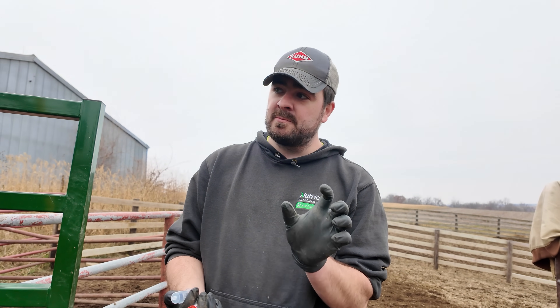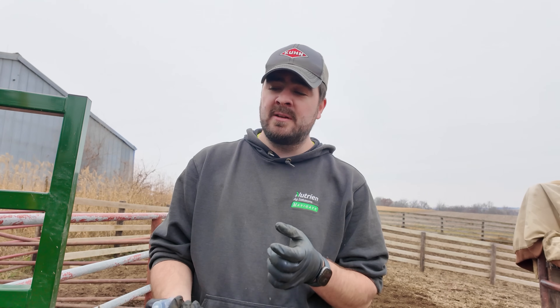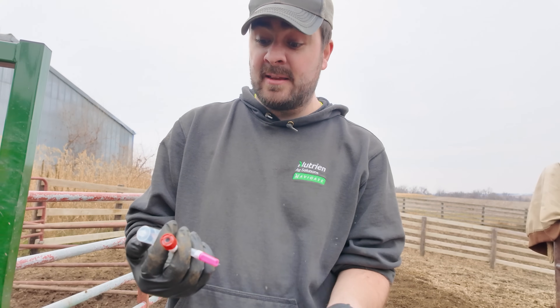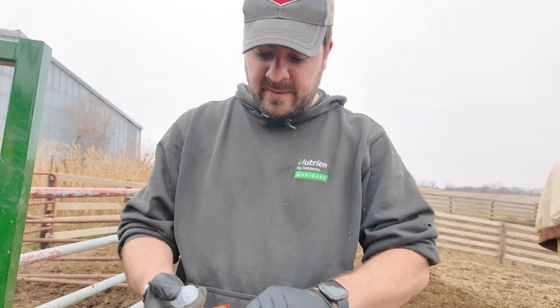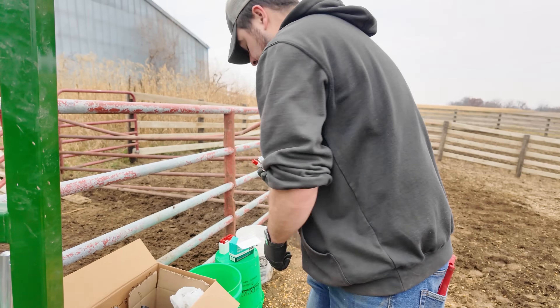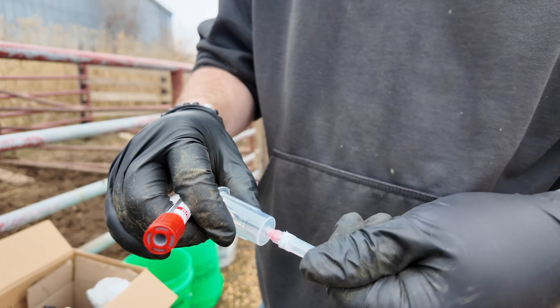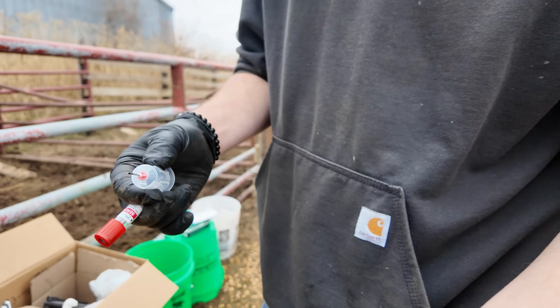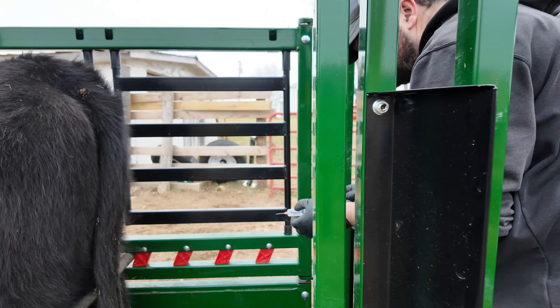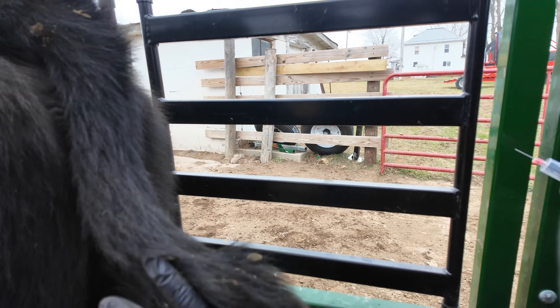We're aiming for a vein that goes right down the middle of the tail. You don't want to go too deep because you'll hit bone — if you feel bone, pull the needle back out. If you've hit the vein, you should get blood. Remove the pink side first, toss that, and insert it into the cup. It looks like a little rubber piece but there's just a needle hidden underneath it. Get the vial ready by putting it in like this — we aren't going to puncture it until we get the needle into the tail.